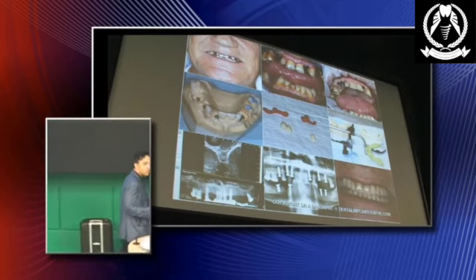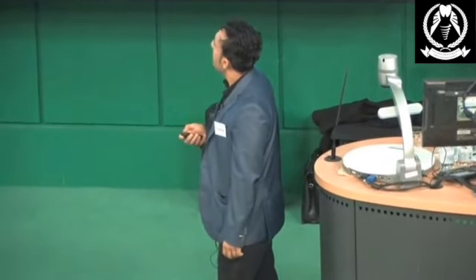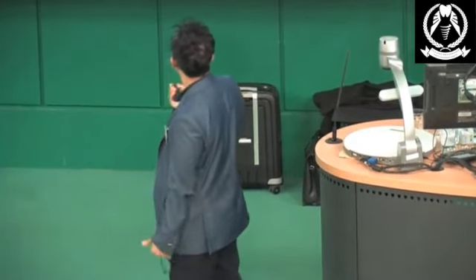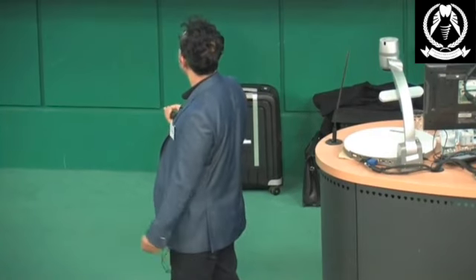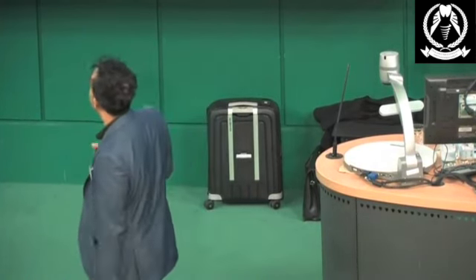We placed 10 implants, but we kept a lot of his teeth. And we went very, very conservative with his treatment and the management of his parafunction. We didn't even crown the front teeth. We bonded them. We placed something called Venus Pearl, a lovely composite that some composite junkies will really like. And we used that from a wax up on a model. And by giving him posterior support and giving him his back bite back, we were able to build up the front teeth and place implants in ceramic, and he was functional and happy at that, and we'd not destroyed good tooth tissue. So it's almost a conservative smile design that Tiff will talk to you a little bit about later, but using implants to replace what we want.